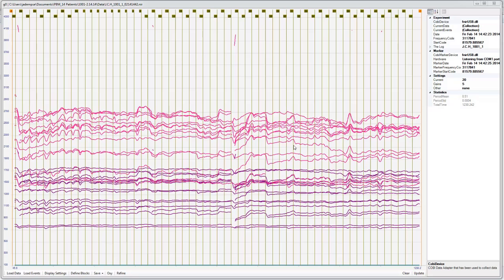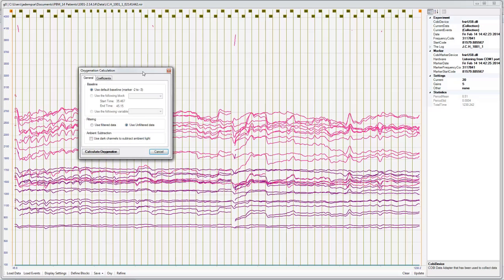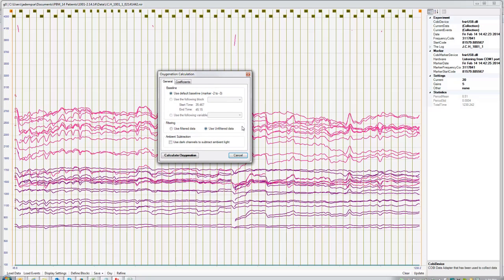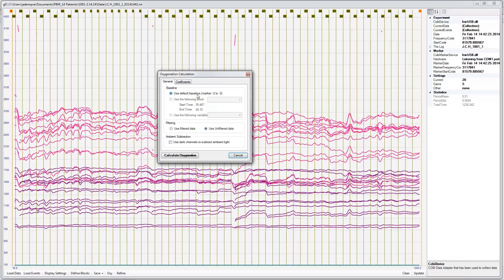Okay, now we're ready to convert all of this raw data into oxygenation. So after we've already cleaned it, we're going to click the Oxy button. And then it's going to ask you what you want to do for this calculation procedure. Usually we're going to use our default baseline to calculate. Although you can create a new baseline if you feel like that baseline was not appropriate or didn't give a good baseline set. And we're going to use filter data and we're going to say use dark channels to subtract ambient light.